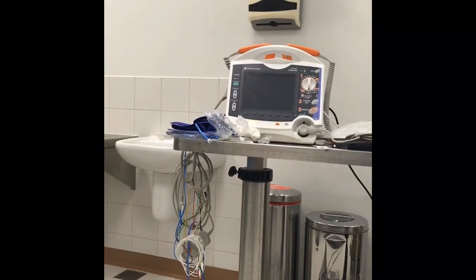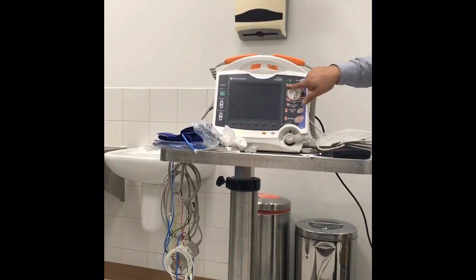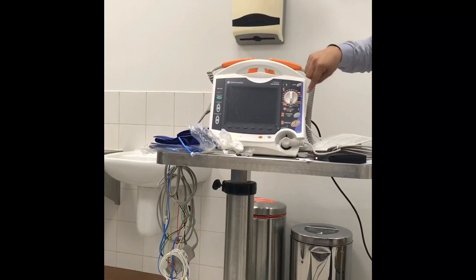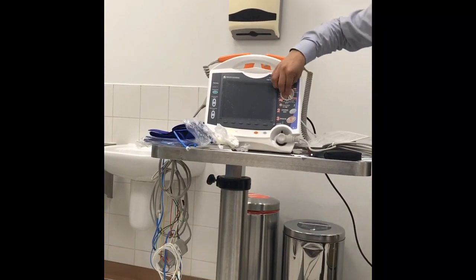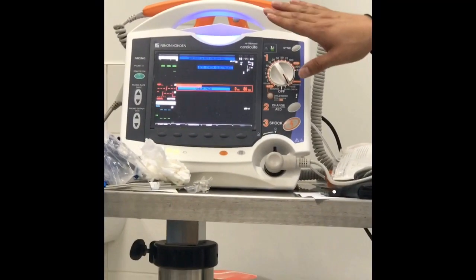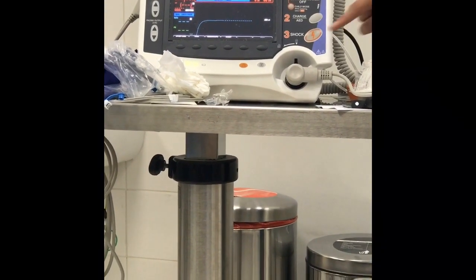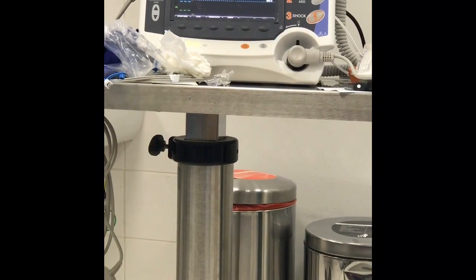So for pacing, we have to use the AED pads, with the chest leads and the ECG electrodes. Yes, the ECG. The pads will shut... No, you have to use ECG. Yes, you have to use it.